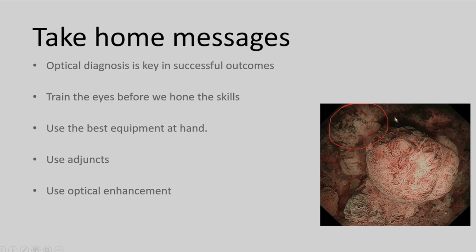And again, this is an area that it's a colorectal polyp. Assess it after resection. After resection, underwater assessment gives us so precise evidence. Because when you see a 7-centimeter lesion, you will not be able to assess each one of those areas accurately. When you resect it, you've got a flattened area, you can assess underwater each one of those areas minutely.